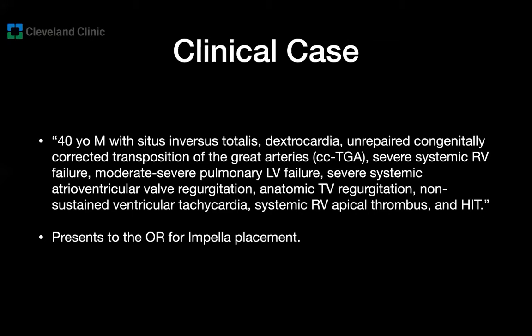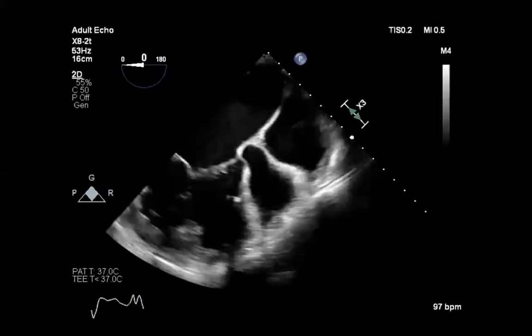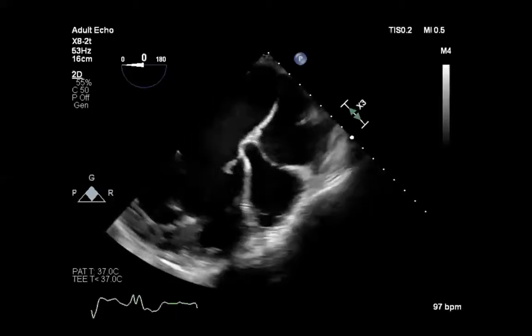This patient comes to the OR for an Impella placement in the systemic right ventricle that is failing. I don't know about you, but I find it difficult to get a clear understanding of the cardiac anatomy of this patient based on the prior description. Then you start your TEE examination, and this is probably one of the first images you are going to get.